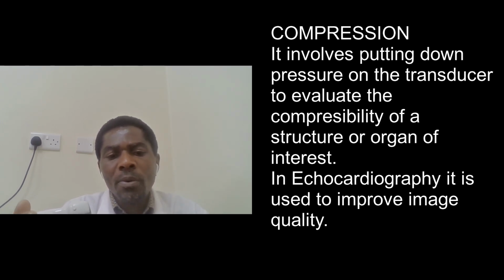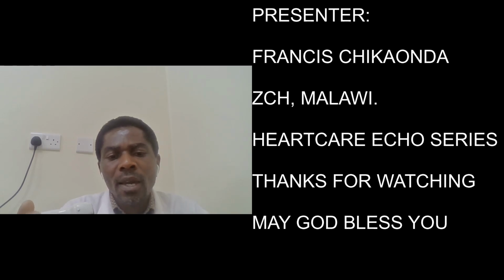So I hope you have learned something, and when doing echo, you will practice these 5 movements that we have discussed: sliding, tilting, angling, rotating, and compression.